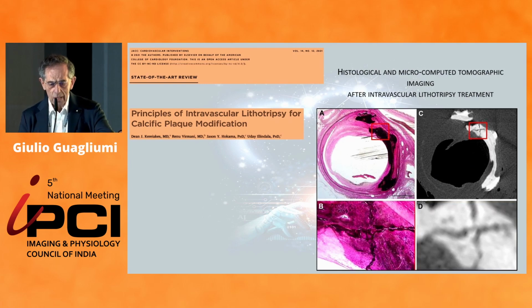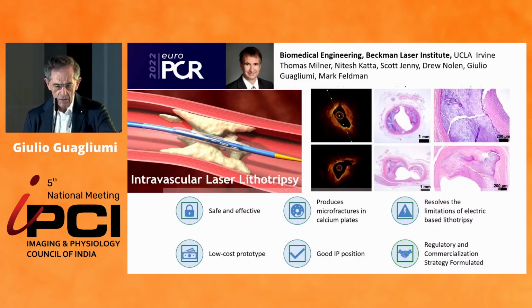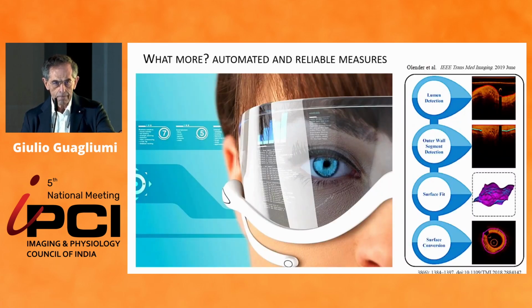Here you have one of the important reasons why we are interested in the detection of the calcium and in the treatment, because we have new entries coming. So this is lithotripsy. This is another lithotripsy that we presented at Innovation PCR that is using different technology and microfibers. And perhaps we will face new technology in the future, not only for cracking, but also for molding the calcified plaque. AI might have additional value in intervention.